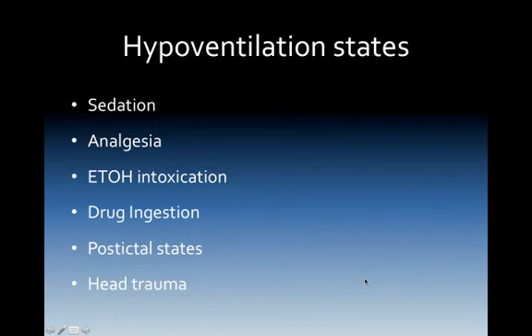Hypoventilation states, things like sedation, analgesia, conscious sedation, increasing end-tidal CO2. We should watch for the need to intubate the patient or oxygenate the patient. In analgesia, same way. And this would be both in sedation and analgesia, that if we get increasing CO2s, we may need to increase their stimulation, either assist their ventilations or put them on oxygen.